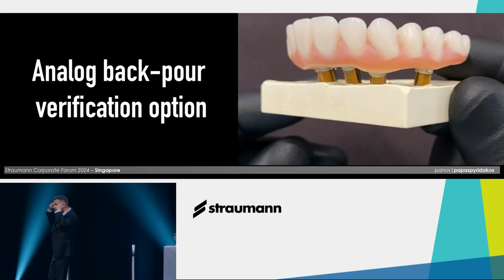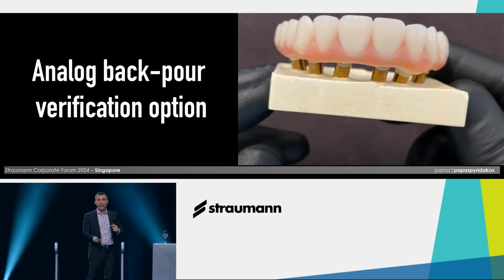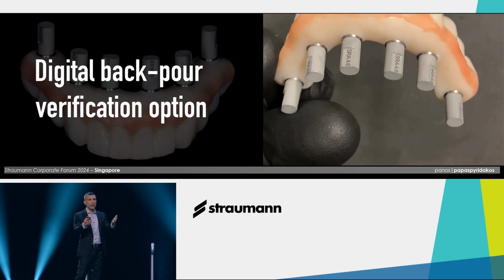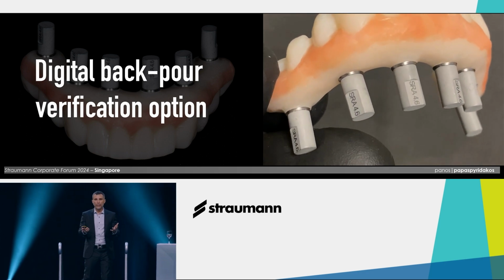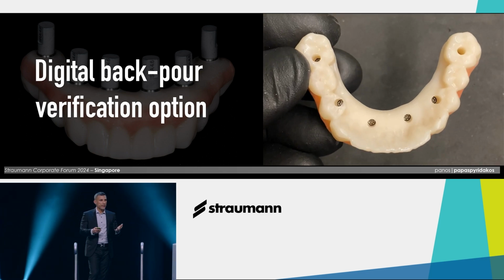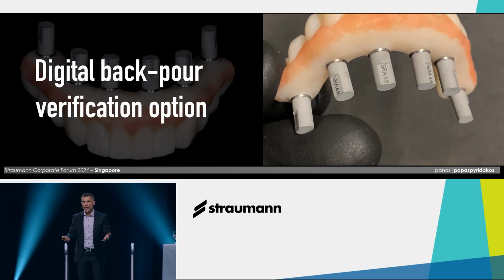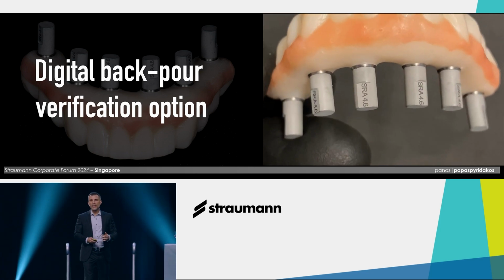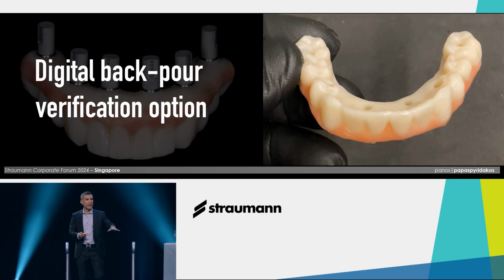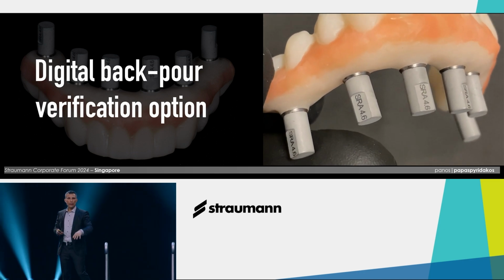But why not do something different now? Use digital technology as a vehicle to do a digital backpour. And this gave birth to the so-called digital backpour technique, or reverse scanning technique, by using those reverse scan bodies attached to a passively fitting provisional to capture the implant position extraorally and bypass all the intraoral challenges that we encountered during scanning of the edentulous mandible, with the elevated floor of the mouth, saliva, lack of keratinized mucosa, the vestibules, and so on and so forth.